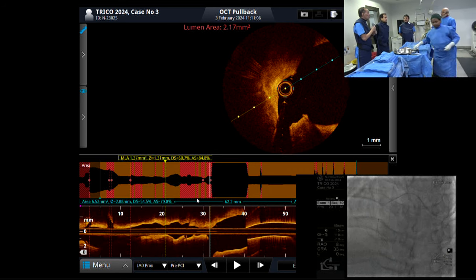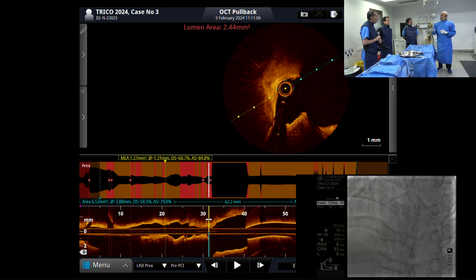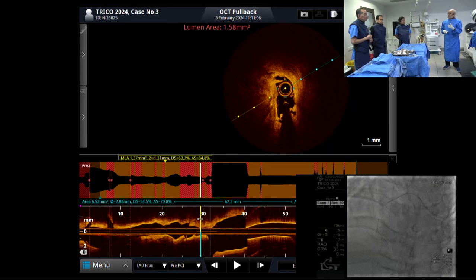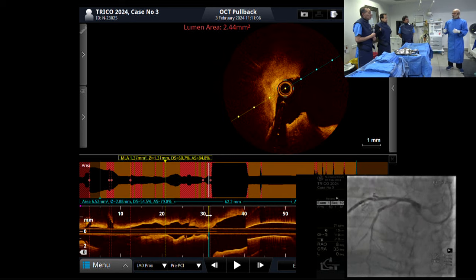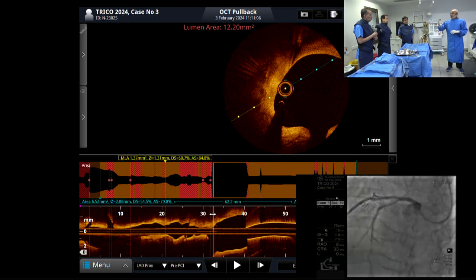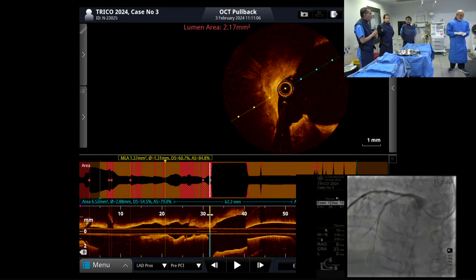Clinically, I feel that if your balloon has a lot of difficulty going inside the calcium, it's a good idea to rotablate and scrape the superficial calcium out, and then do IVL to have better breakage. Otherwise, if you can open it up with a balloon and use IVL, no problem, then you don't need it. But out of 10 cases, in 1 or 2 or maybe 3, I may have to use both. Okay, how about you, Rajit?